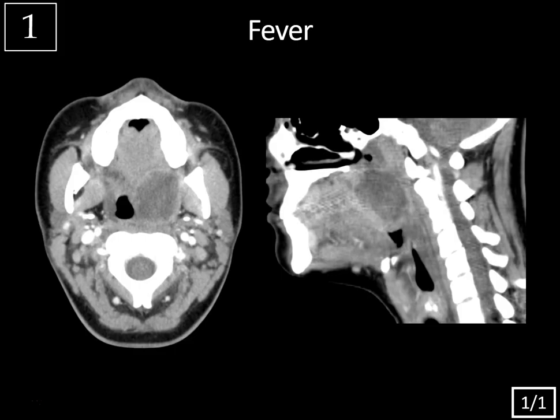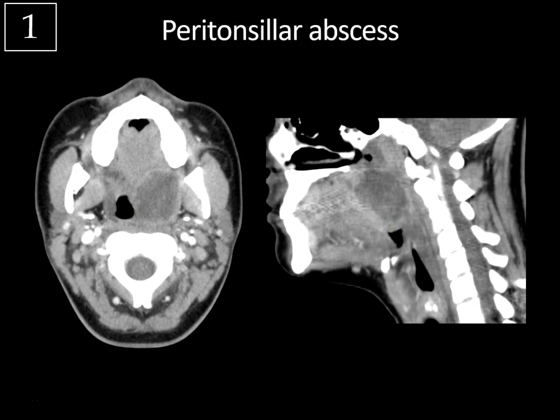Case 1, history of fever, CT neck. So we've got axial and sagittal contrast-enhanced CT scans of the neck at the level of the oropharynx. We have a large rim-enhancing fluid collection, centrally hypodense, in the region of the left tonsillar pillar and the left palatine tonsil. There it is on the sagittal view with that rim enhancement and central hypodensity, and this is typical for a peritonsillar abscess.